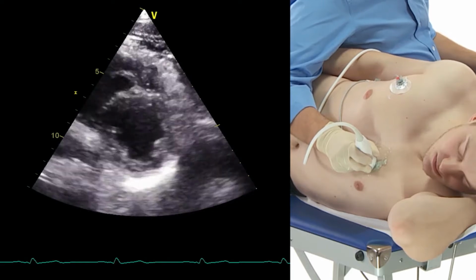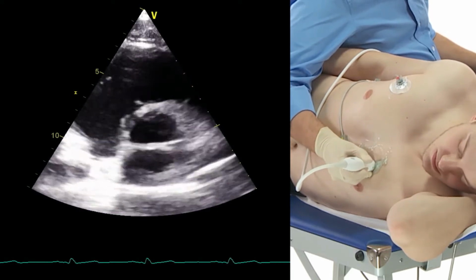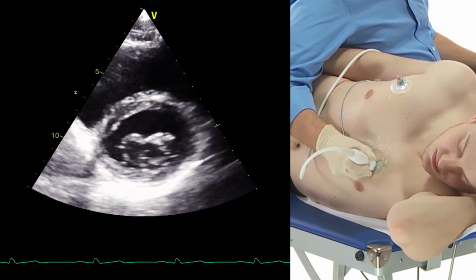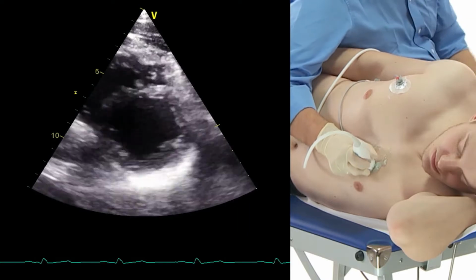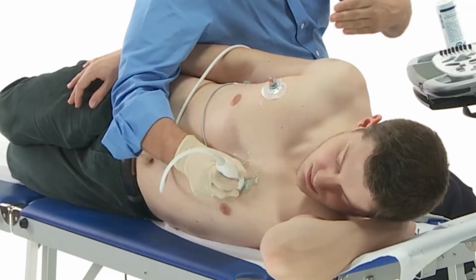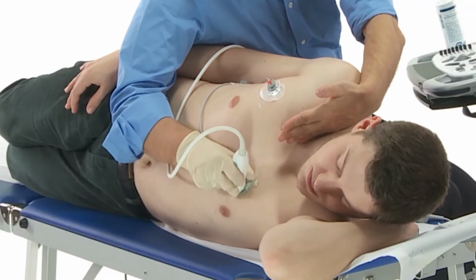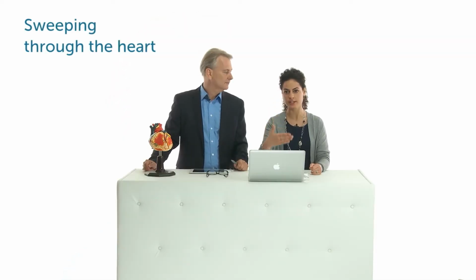So essentially, by performing such a sweep from the base of the heart down to the mitral valve, down to the ventricle, down to the apex, gives you a full appreciation of the entire heart. However, remember, we have to follow the axis of the heart, the base and the apex. So we are now perpendicular to this axis and tilting up and down. So we sweep through the entire heart.